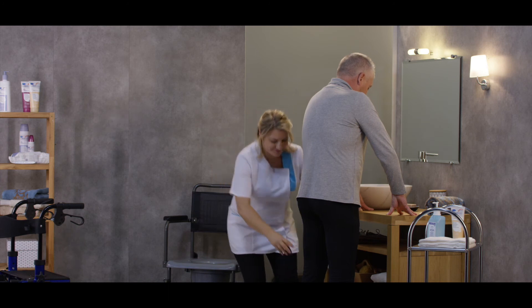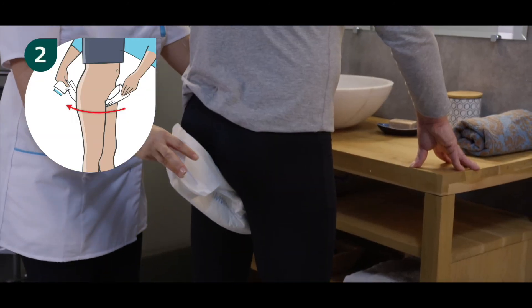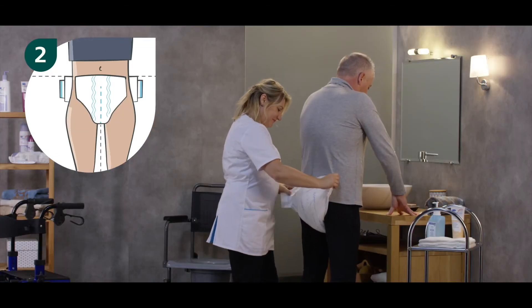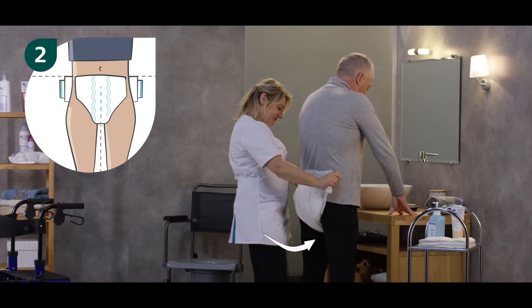Step 2: place the product on the resident from front to back. Unfold the product in the back and then unfold one side panel, stretching it with reasonable force around the side of the resident.